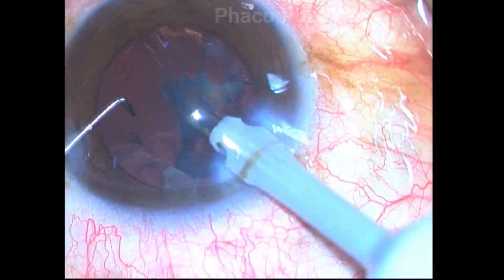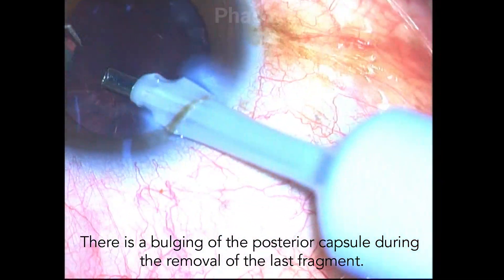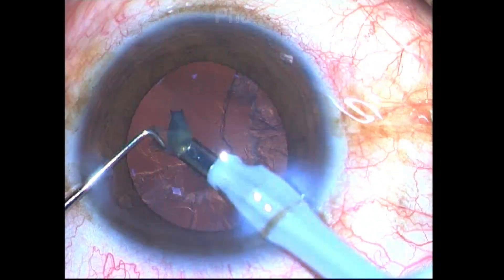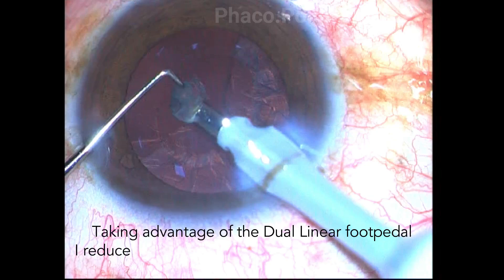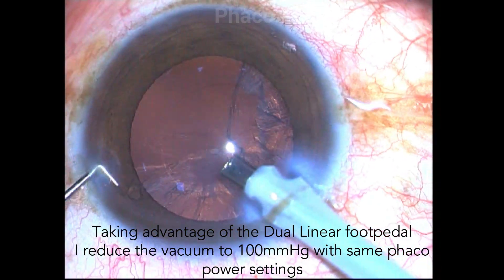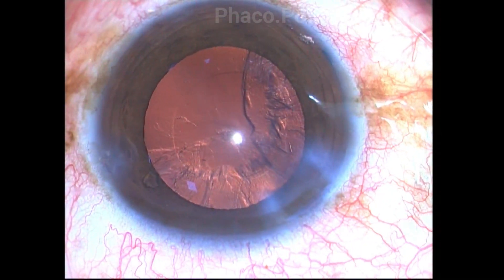Once the entire nucleus has been emulsified, there is a slight tendency of the posterior capsule to rise as I'm removing the last piece. Therefore I use the dual linear foot pedal to reduce the vacuum while staying at the same phaco power, and I am able to emulsify this final nuclear fragment.